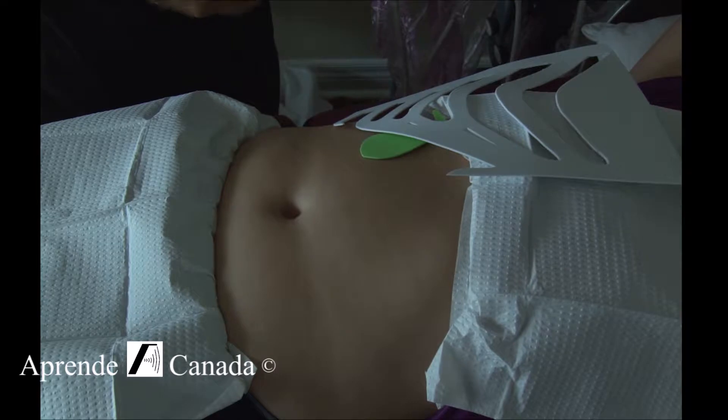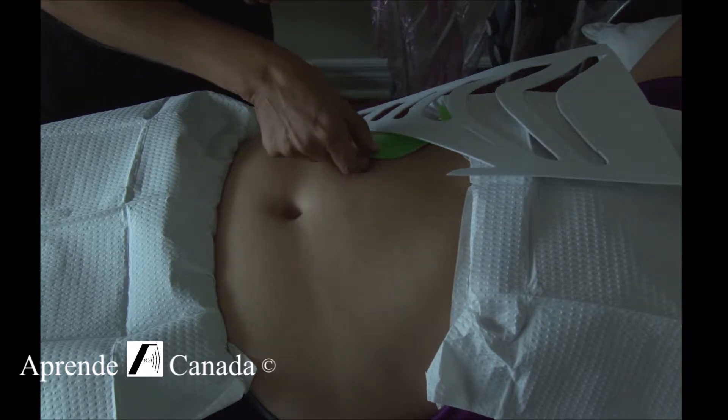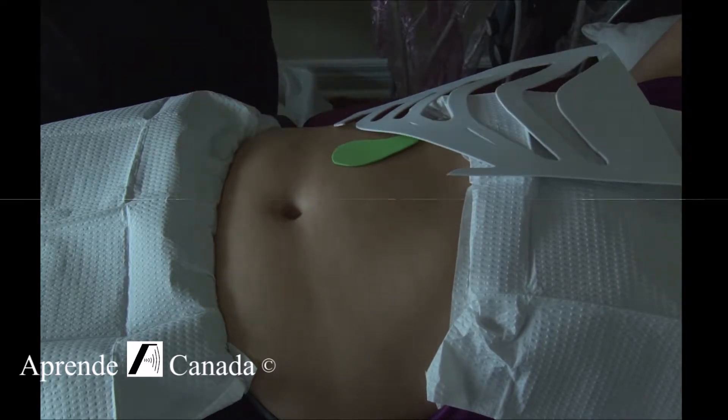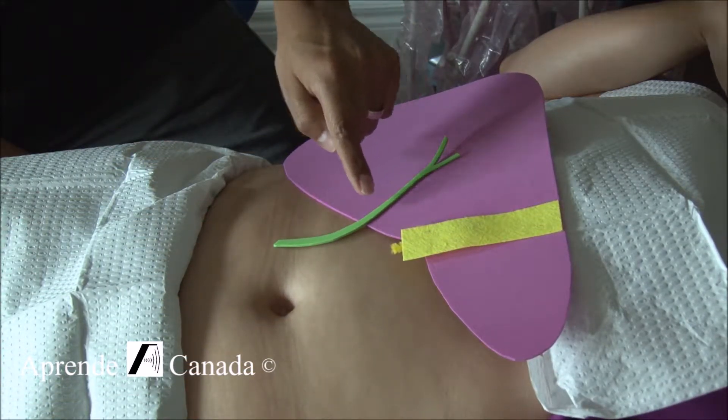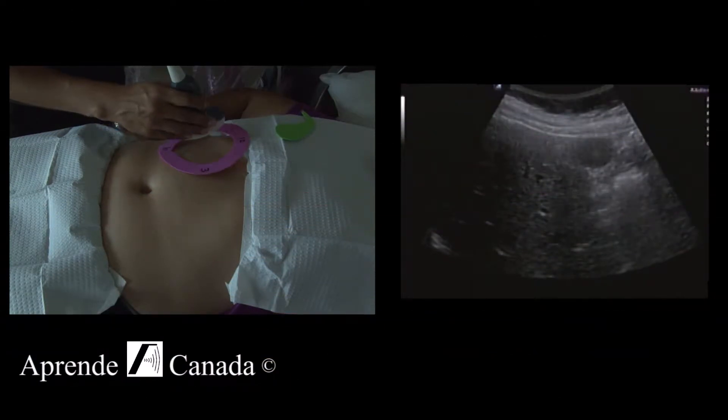Depending on the patient's body habitus, sometimes the gallbladder will be farther down from the common hepatic duct and will be a little diagonal. For a novice sonographer, it's hard to know how much to turn the probe. What I would suggest is starting from 12 o'clock.